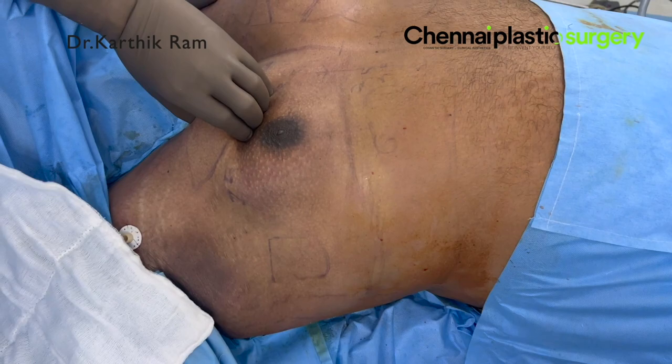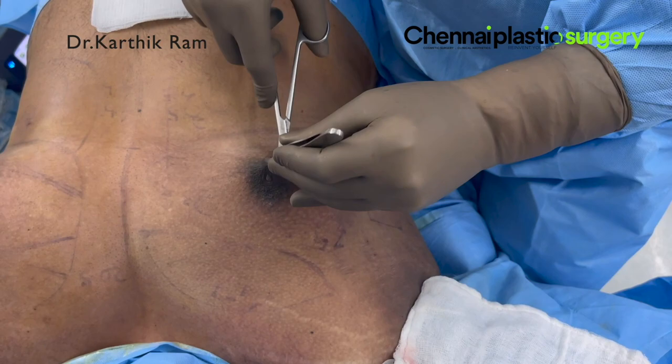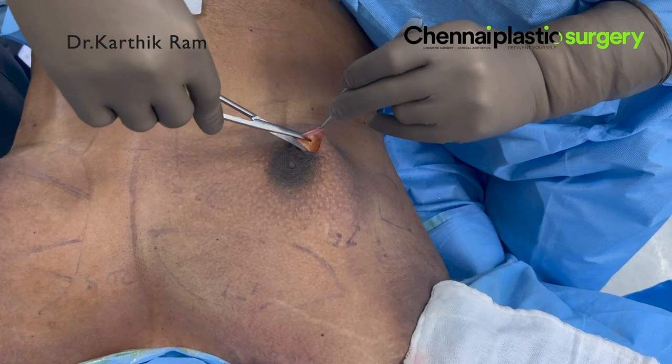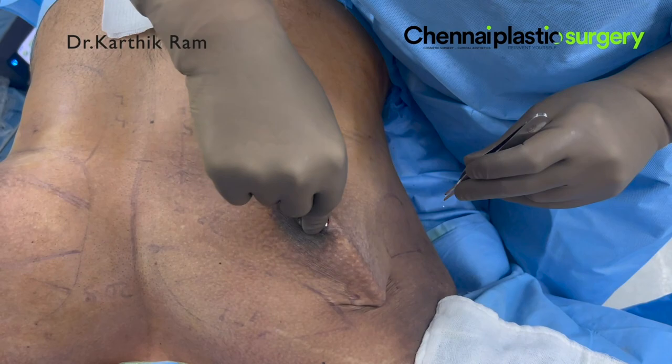Now you can see we have completely removed the fat everywhere. There we kept the volume — that area is over the muscle and we want to retain the bulk of the muscle. Now we made the cut. If you see the cut, it will be less than one-fourth of the circumference of the areola — I made it a little bigger in this case because it is a huge gland. Now we are dissecting the gland completely from the skin, not leaving any remnant of the gland or the fat. The first step is releasing the skin from the gland.